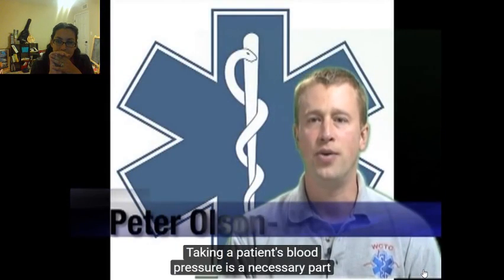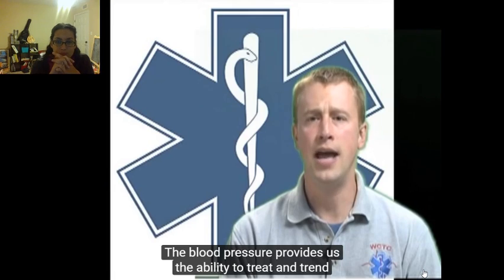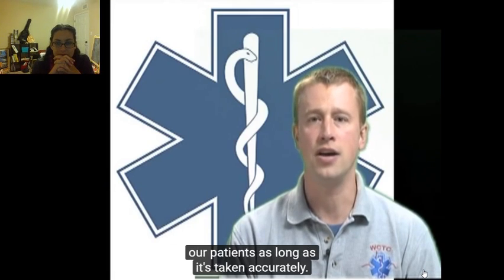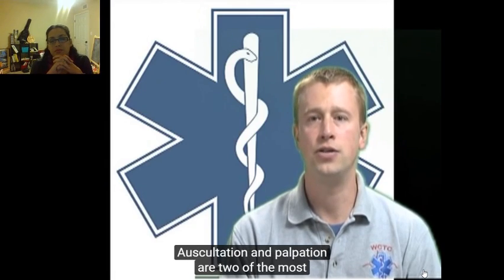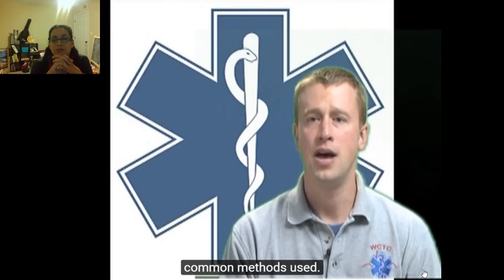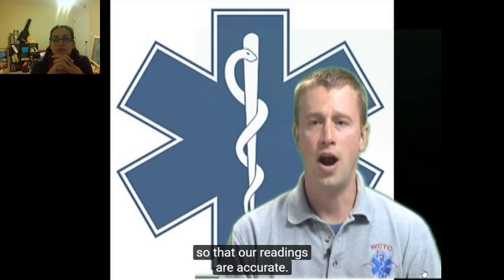Taking a patient's blood pressure is a necessary part of our patient care. The blood pressure provides us the ability to treat and trend our patients as long as it's taken accurately. Auscultation and palpation are 2 of the most common methods used. However, there are a number of factors we should keep in mind so that our readings are accurate.